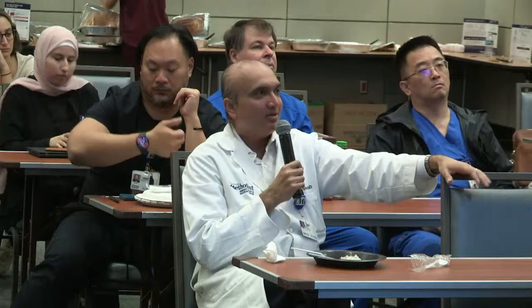Okay, and then the other question I have, ultimately what you're measuring here is kind of longitudinal shortening. How about just a simple measure like MAPSE, mitral annular plane systolic excursion? Kind of like what you do for TAPSE on the RV?